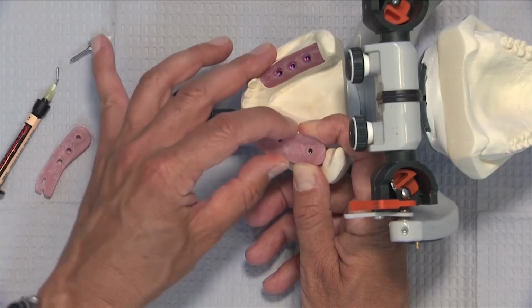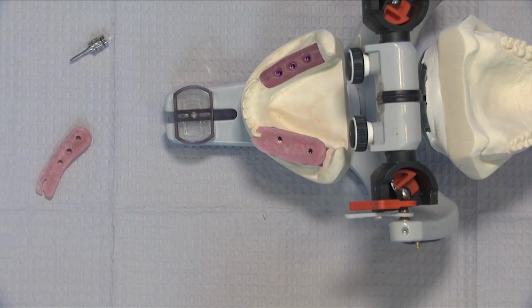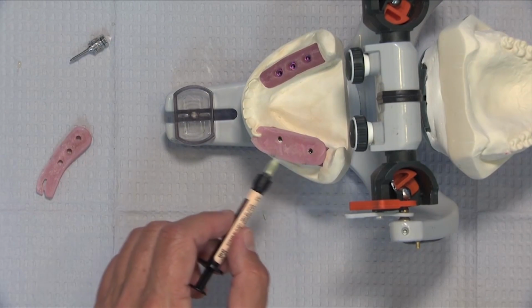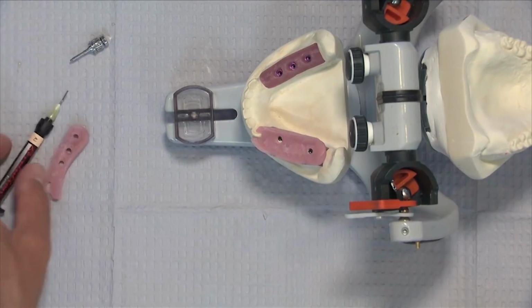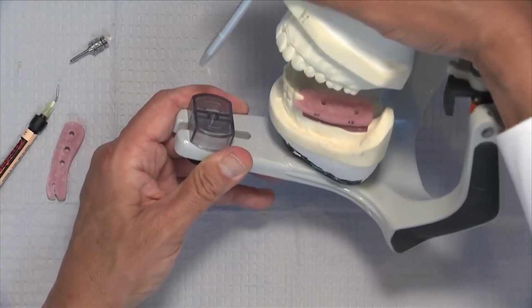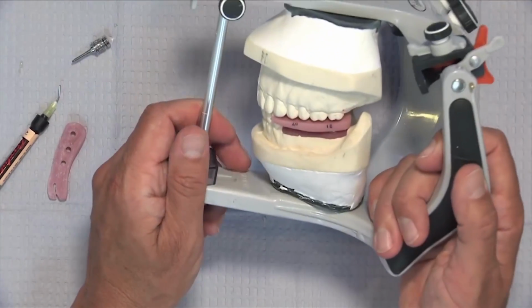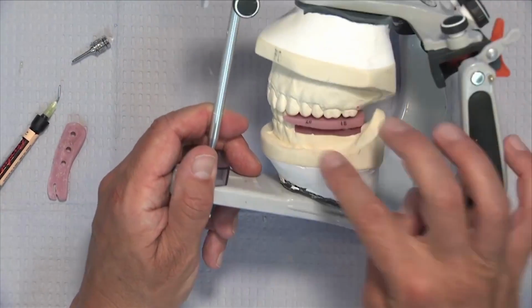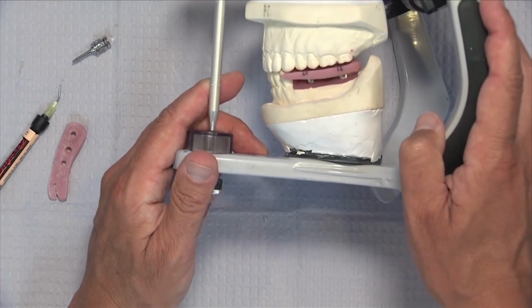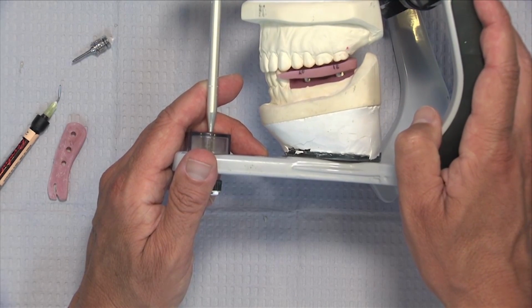Now typically when you get this back from the laboratory, what we're going to send to you is going to have the occlusal surfaces of the opposing teeth already in place here in this hard acrylic. So when you put this into place, the first thing you're going to have the patient do is bite together and verify and see if you happen to get the bite right. If everything happens to be mounted correctly when they bite together, it'll fit into the tooth indentations on the bite index. But the chances realistically of this happening are probably only about 5%.